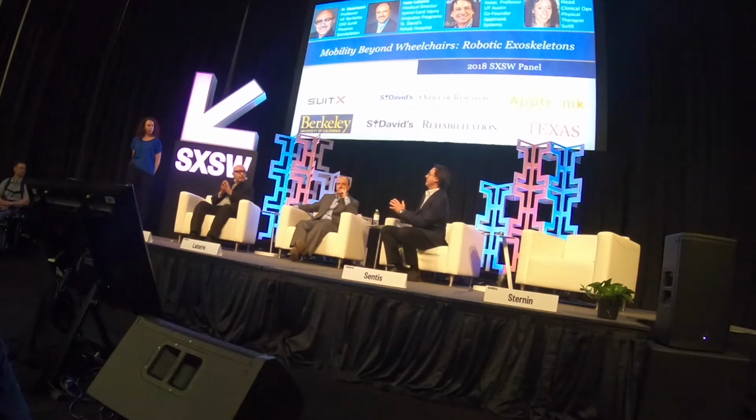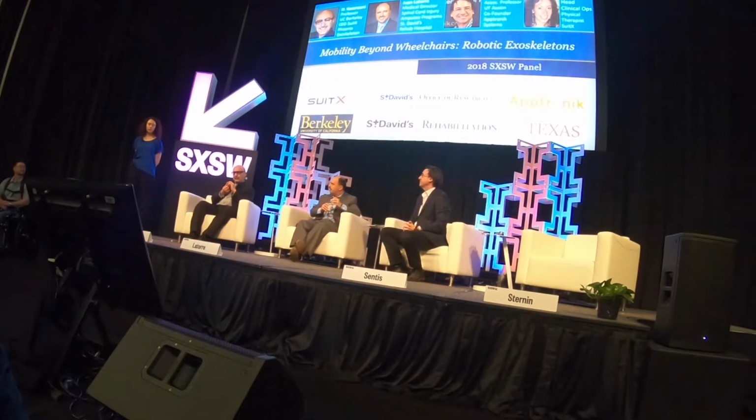So the fact that you use it for rehabilitation, does it mean that they come 1 hour at a time? How long would a session last, and how much can they withstand? Not being an expert on the therapy, I guess they get pretty exhausted, right? Yeah. How does it work? It's exercise. For most people, physical therapy sessions generally last approximately an hour, and currently that's how long our training sessions last. But the transition is that it should extend beyond just those training sessions to someone being able to use it throughout the day.